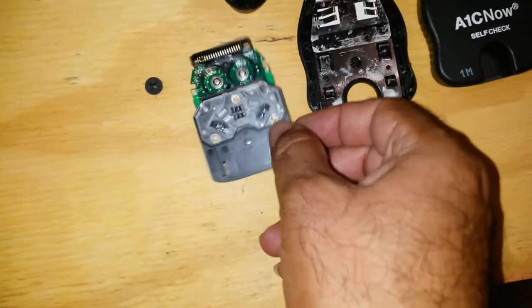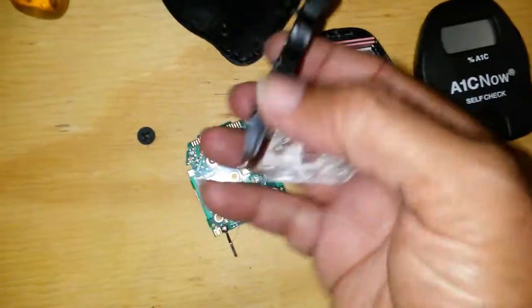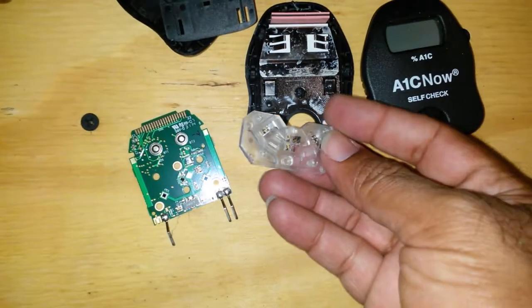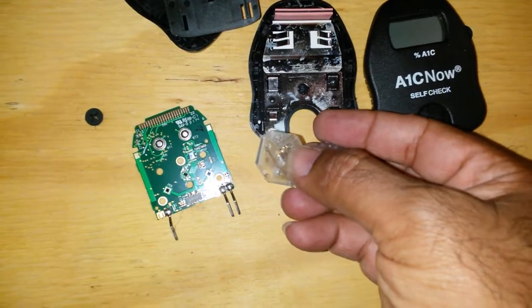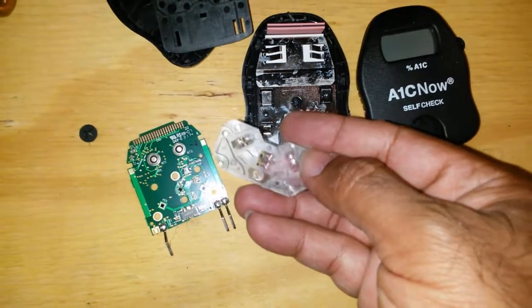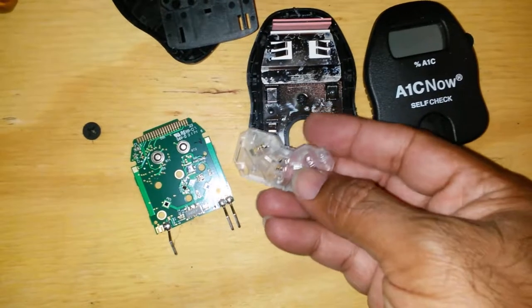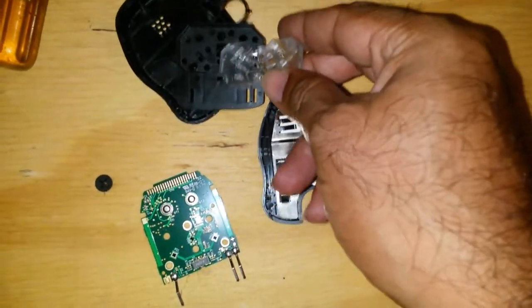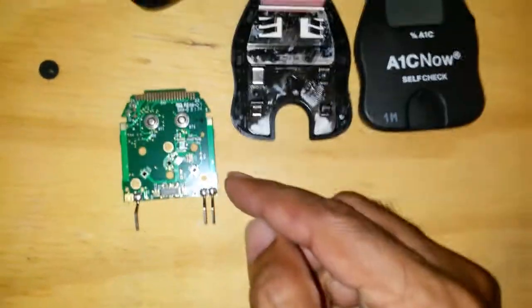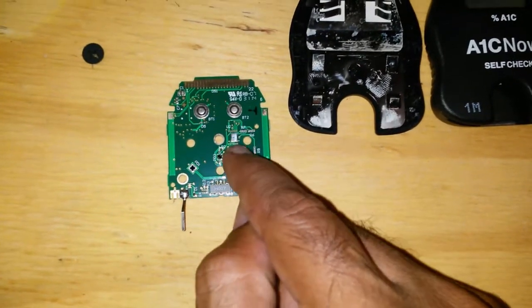Interesting, this whole thing has a lot of, let me take this out, right, wave guides to it. If you look at this, you can see there's a bit of fairly reflective plastic there, well defined optical grade stuff for optical operation. This is clearly an optical approach, and it's within a housing in here that keeps it specifically where it needs to be. We'll look very carefully at that under the microscope.